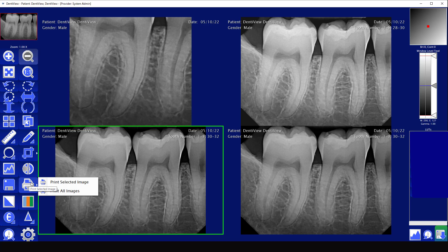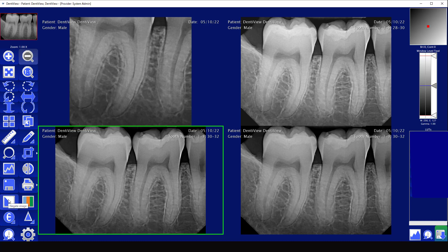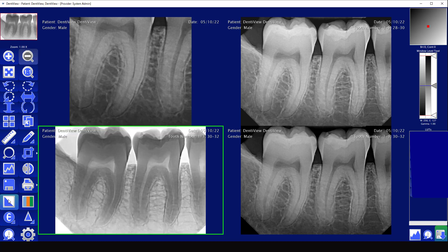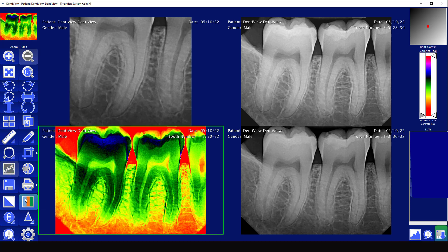Print is pretty straightforward — you can print the selected image or print all of the images. Then you have the negate image option, which is going to invert the image for you, and you also have the colorized image.